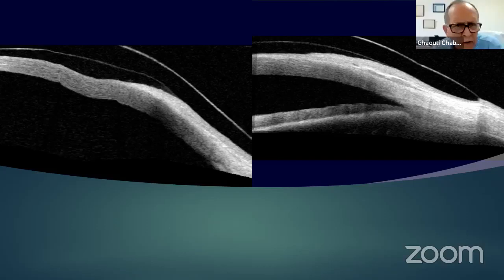For the people who have had herpes zoster, herpes, or adenovirus conjunctivitis, and they have an irregular surface, some people are thinking that putting contact lenses, even scleral lenses, will put the cornea in danger, at risk. What do you think about this?